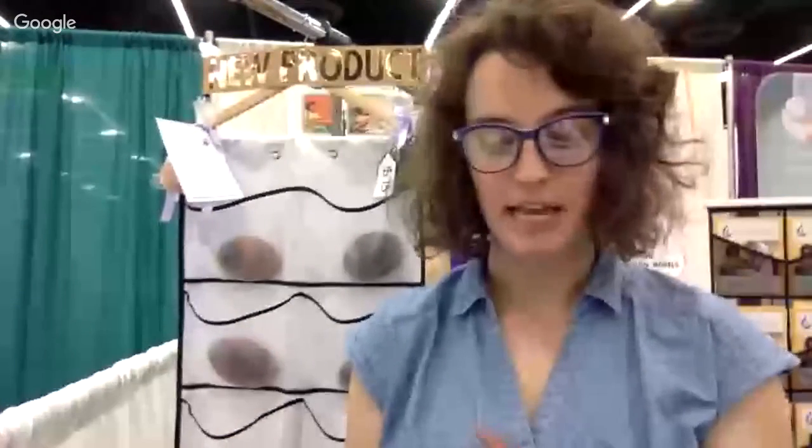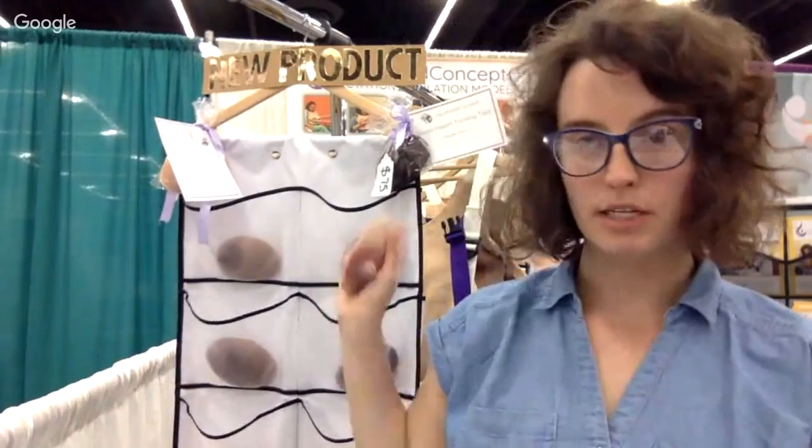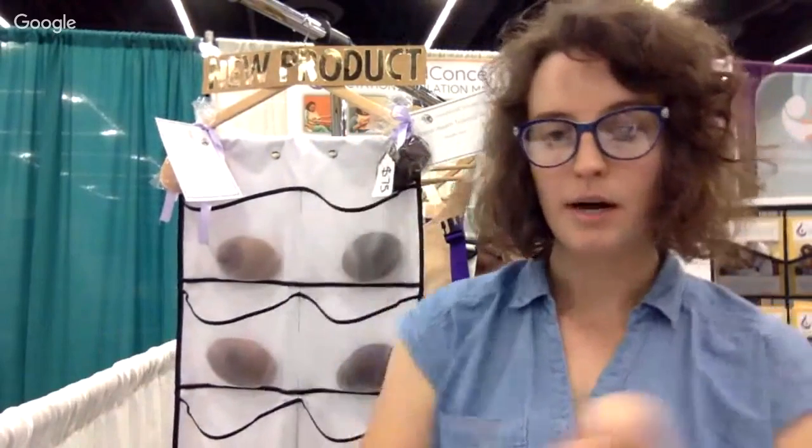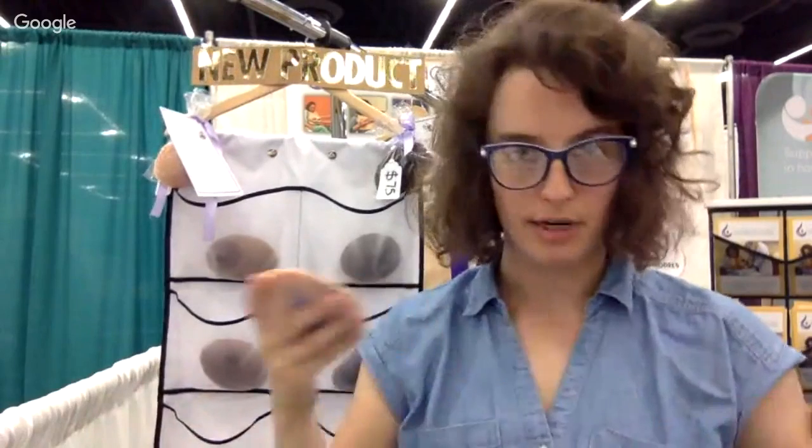Hi everyone. Again, my name is Anna. I'm the CEO of Liquid Gold Concepts Breast Health and Lactation Education Company. This is the fourth and final segment of a series in which we're discussing our new products. This is the breast health training tool. And the goal here really is to teach physicians, nurses, students, lactation consultants, all healthcare providers the basics of breast health.